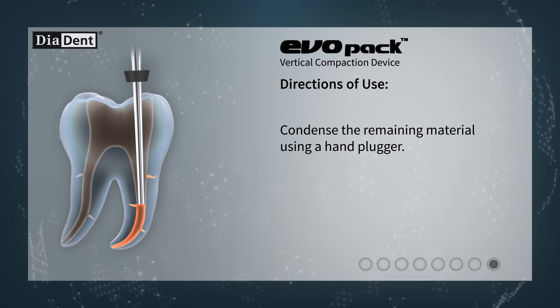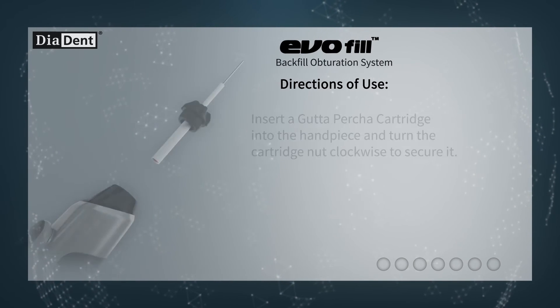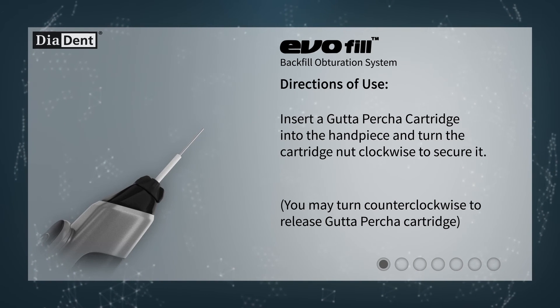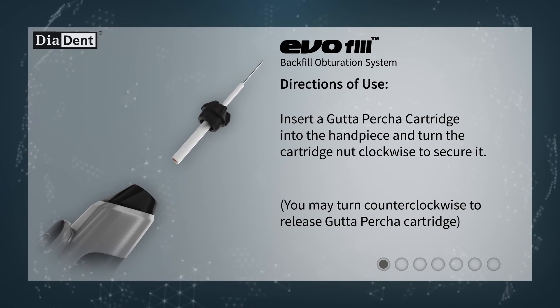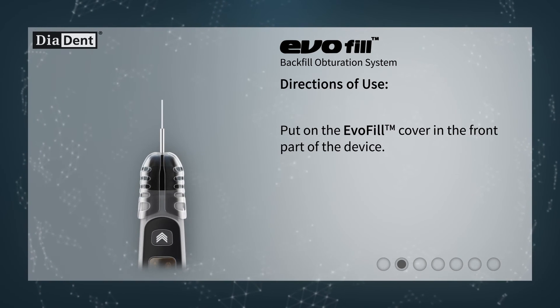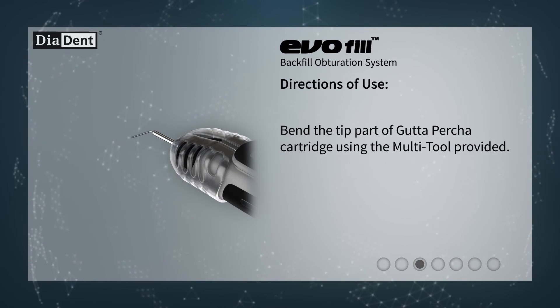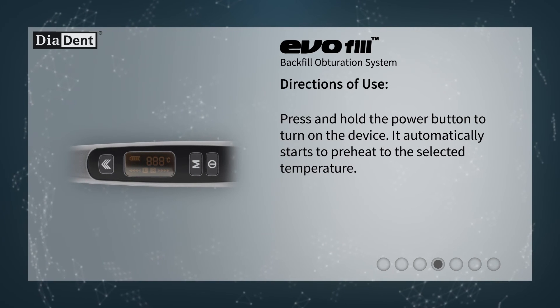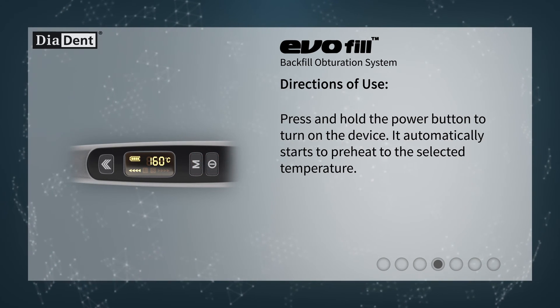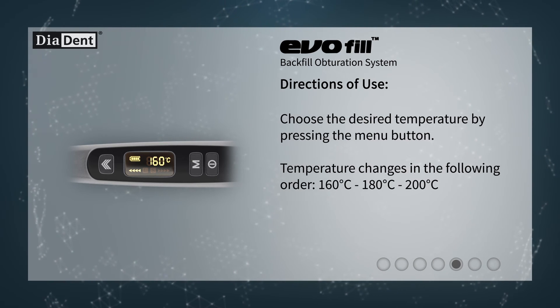Condense the remaining material using a hand plugger. Insert a gutta-percha cartridge into the handpiece and turn the cartridge nut clockwise to secure it. You may turn counterclockwise to release the gutta-percha cartridge. Put on the Evofill cover in the front part of the device. Bend the tip part of the gutta-percha cartridge using the multi-tool provided. Press and hold the power button to turn on the device. It automatically starts to preheat to the selected temperature.